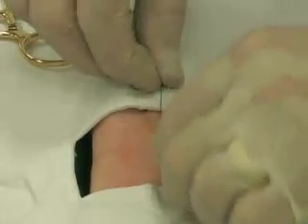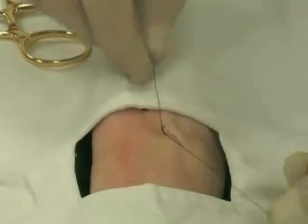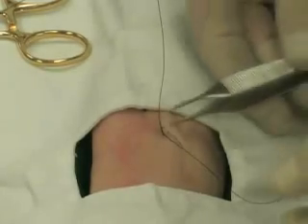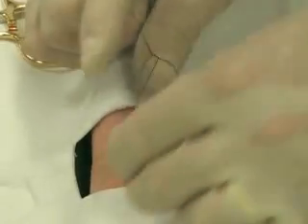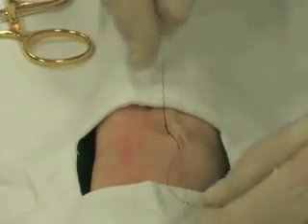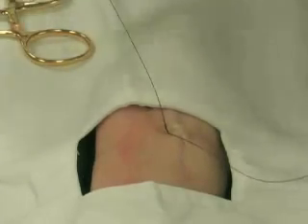Here you can see that the corner stitch would avoid some necrosis to the tip of the flap, which might otherwise face vascular compromise with a series of simple interrupted sutures. Here we'll throw a second time to have a surgeon's knot, and you may appreciate how this will stay better until you place your second suture.